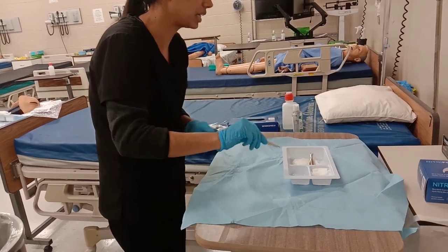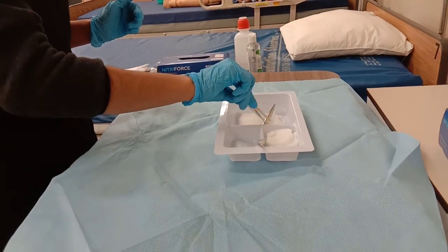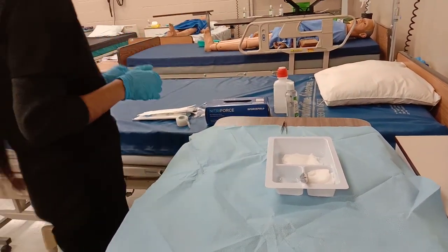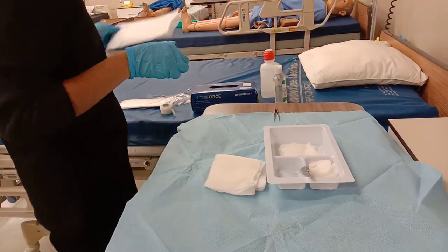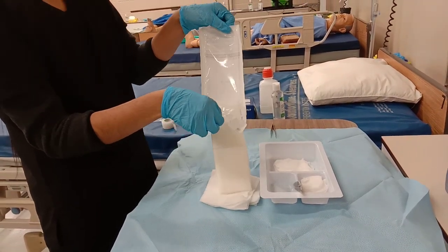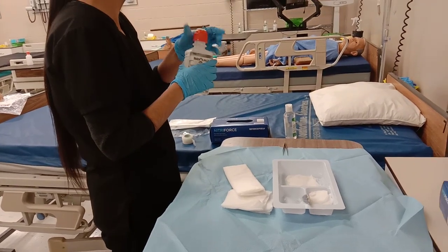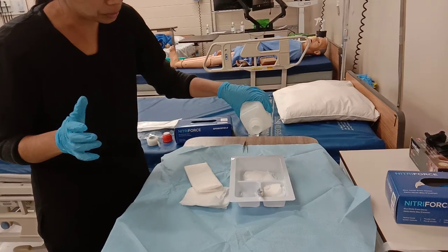I have repositioned my tray. Now I'm going to manipulate my supplies. I'm going to place it here. Now I'm going to open the sterile gauze, the abdominal pad. So now I'm going to pour the solution from an appropriate height.